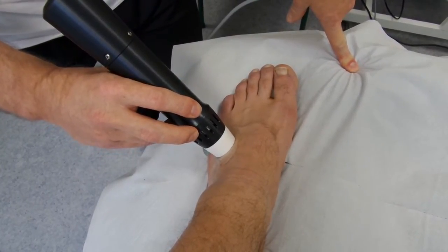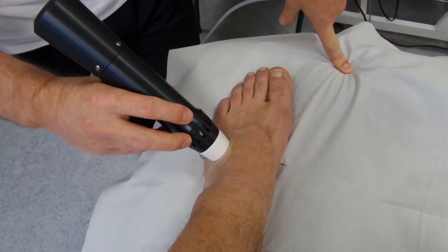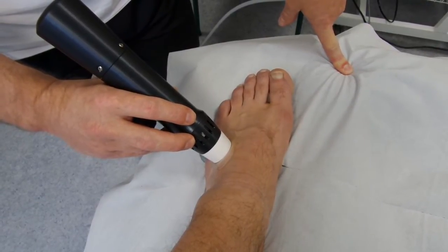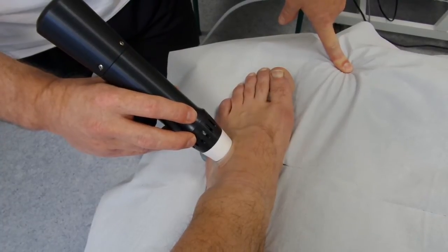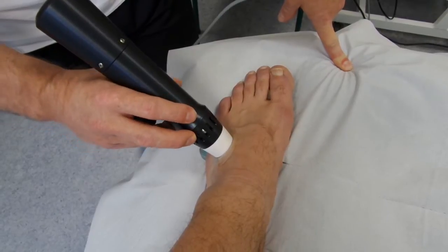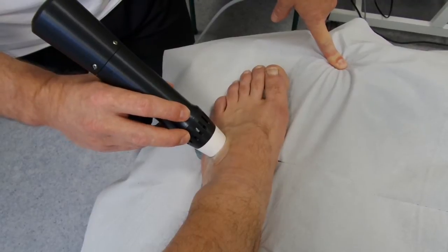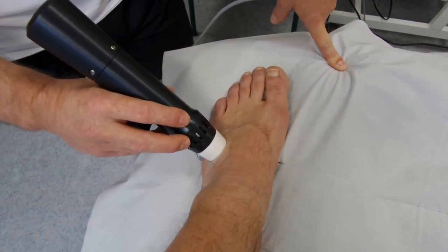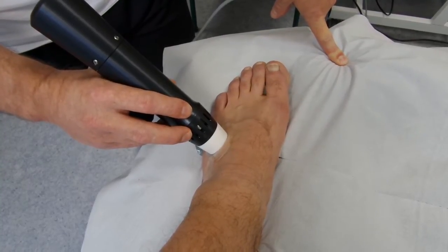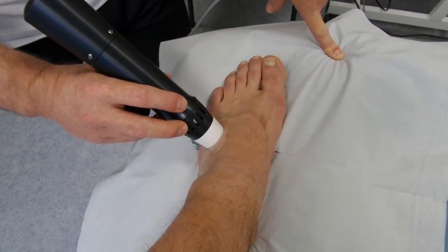As per normal, we move around the shockwave head until we find areas where the tone changes. When the tone becomes deeper and more resonant, we stop temporarily on that area for probably two to four hundred shocks and then move around. The moving around is the massage version onto the foot, and the staying still is what some people would call the trigger point or myofascial method.